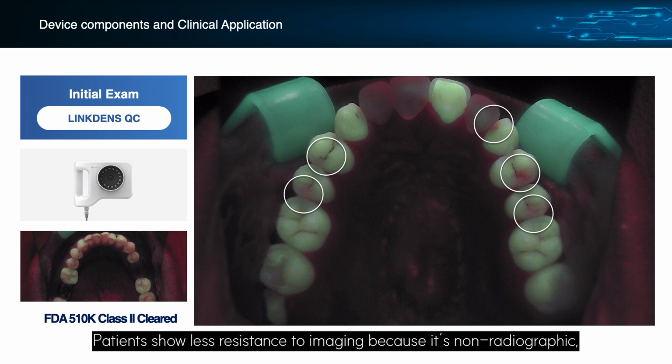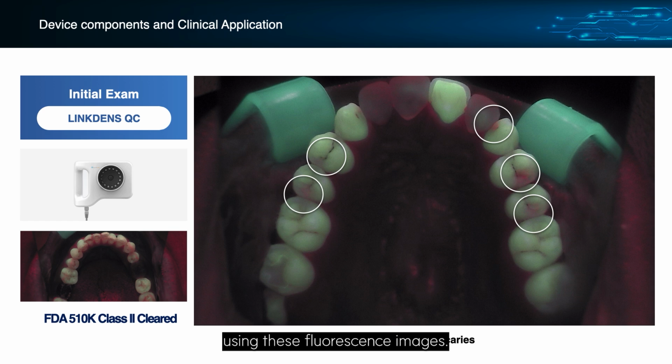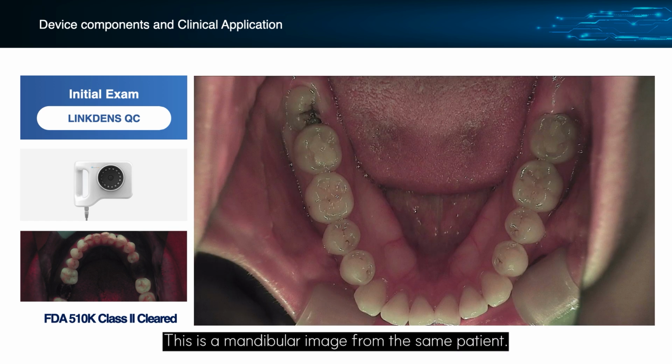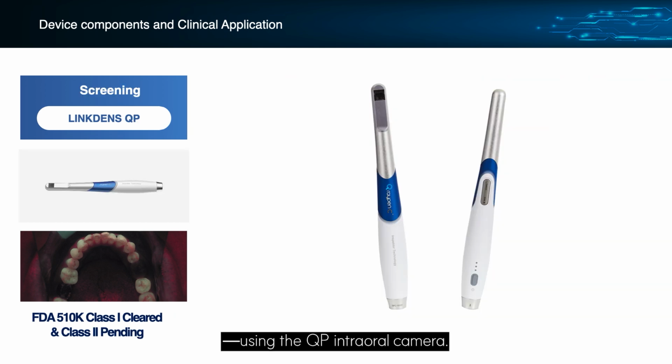Patients show less resistance to imaging because it's non-radiographic, and even those who regularly refuse X-rays can be evaluated using these fluorescence images. This is a mandibular image from the same patient. You can clearly see the red fluorescence within the circled area. So after scaling and removing the surface biofilm, we move on to the next step using the QP intraoral camera.